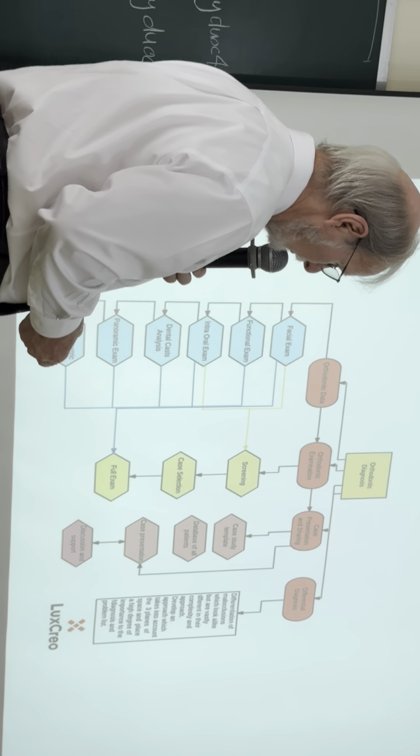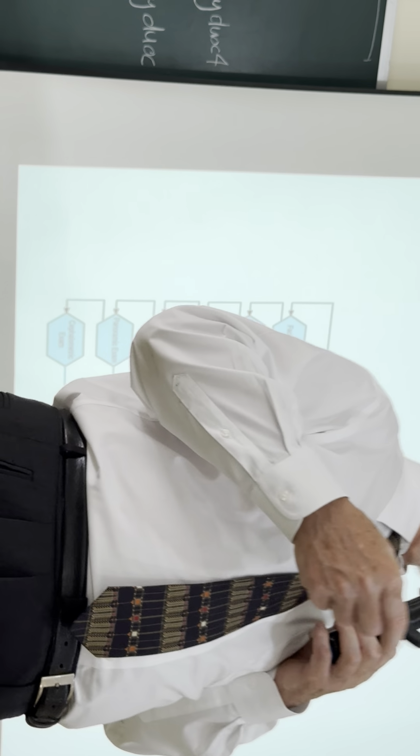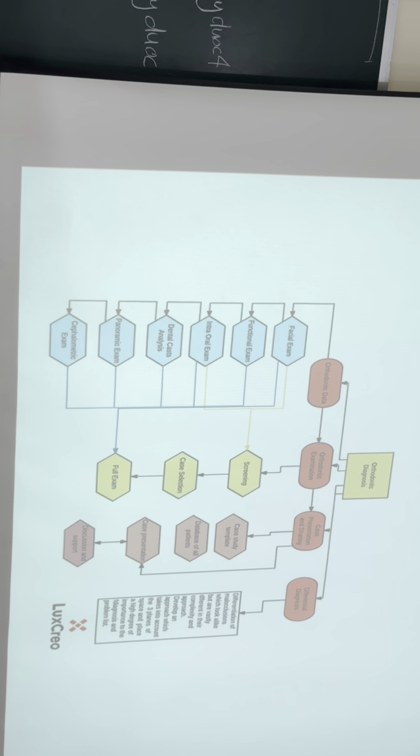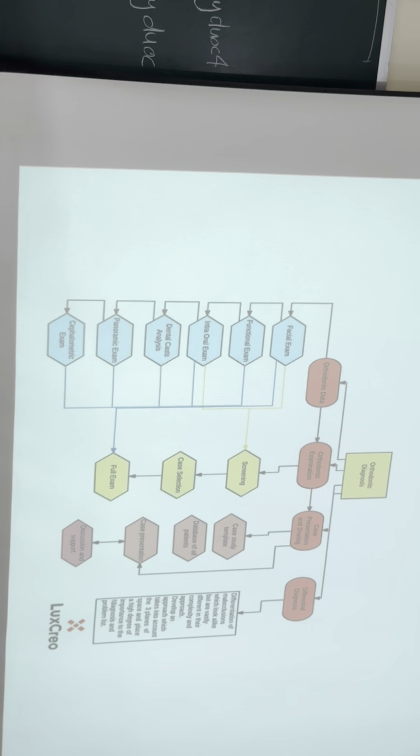I always get the same problem when I come here in Vietnam. It looks like the patient is dictating the treatment. It may be okay with braces, but it's not okay with aligners. Because with aligners, if you don't select correctly, you will be in trouble after 6 months and you cannot go back. So be very careful with this.